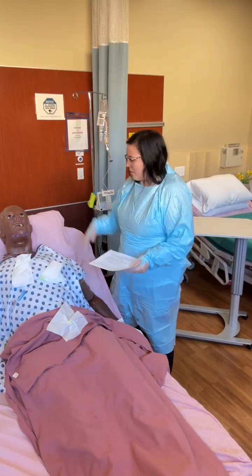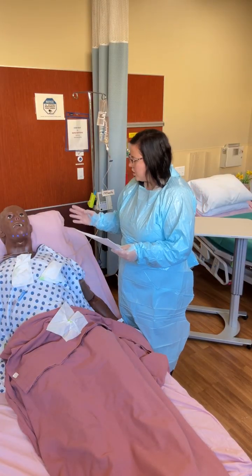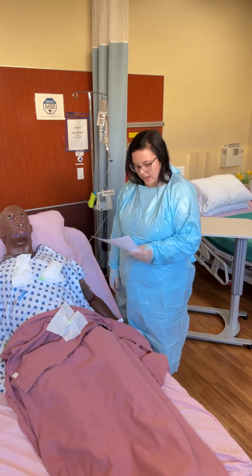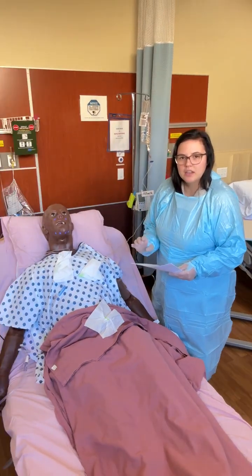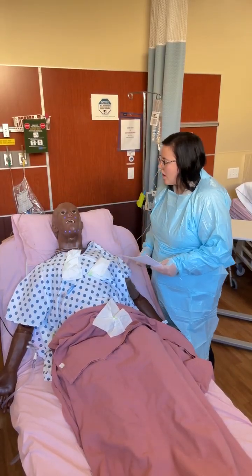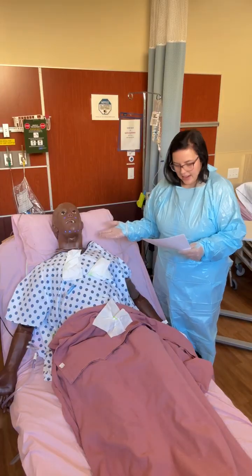All right, so let's talk about the simulator. He has functioning eyes, so his eyes will open and shut. You can see that he's blinking there. And then he also has these blue lights. You should be able to see them. Have Kristy turn just a little bit right there. He has lights right here and up here that are blue, and that is what we use to show that the patient is cyanotic.